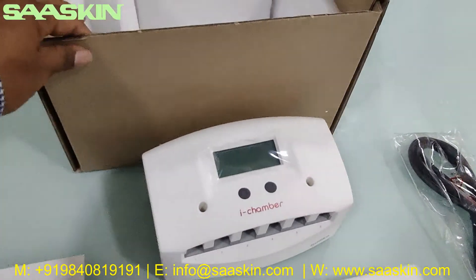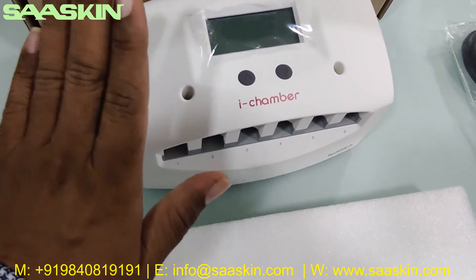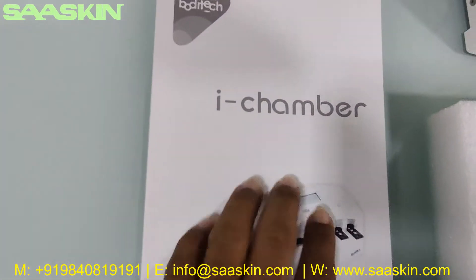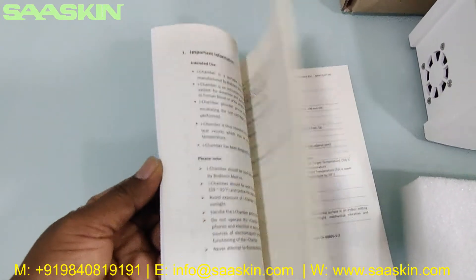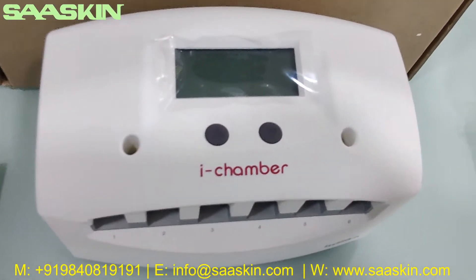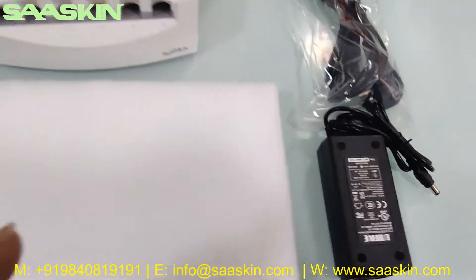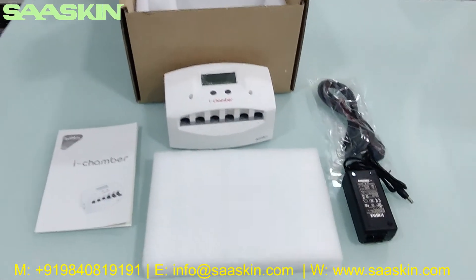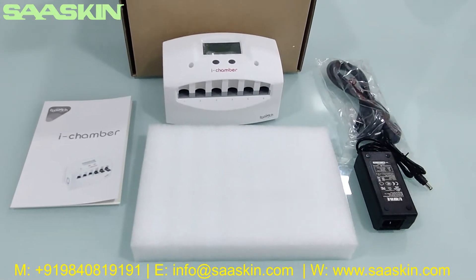So if you look at the unboxing, let me quickly introduce the contents here in the i-Chamber from Bodhi Tech. You get one instruction manual for the i-Chamber — a complete instruction manual about the installation and usage, with complete details. You also get one power cable and one power adapter along with the machine. This is how the total box looks like — this is the complete unboxing of the i-Chamber from Bodhi Tech, used along with the i-Chamber instrument.